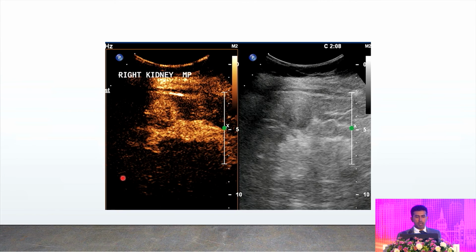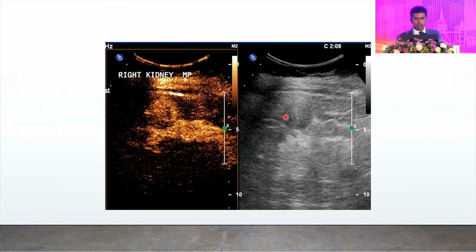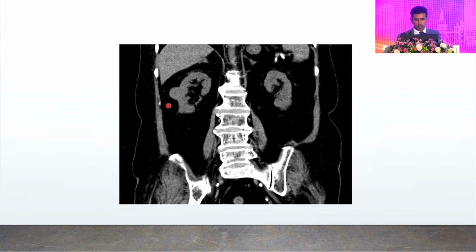Cryoablation is similar in technique. This is the small RCC here, and these are contrast enhanced ultrasound images demonstrating hypervascularity. It is partially exophytic, so these are the ideal lesions for ablation, because we can prevent the leakage of urine and minimize the damage to the renal collecting system. So ideal lesions will be the cortical lesions, and the best are exophytic ones.